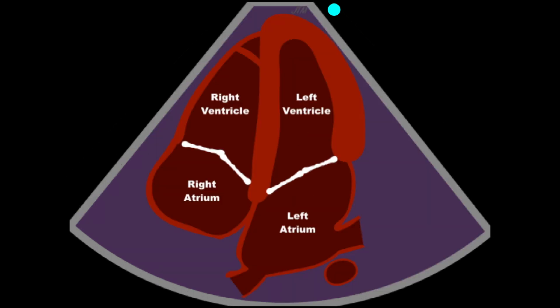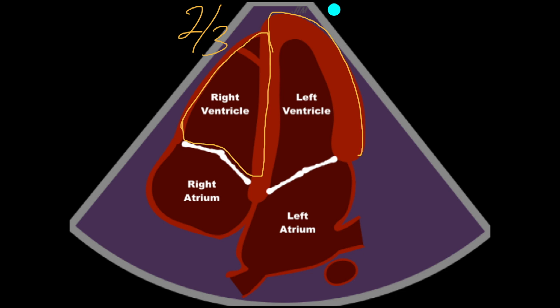Another rule of thirds is to determine the size of the ventricles. When we look at the right ventricle and take its size, that should be about two-thirds the size of the LV. If it's not, that would be concerning for dilatation or enlargement of the right ventricle.